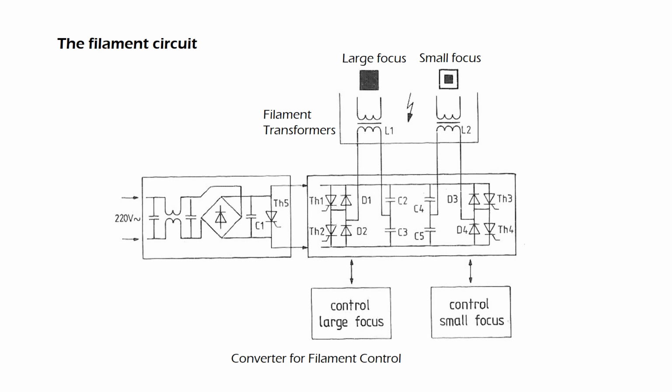During the exposure, the tube current control circuit takes over the control to send feedback of the measured actual tube current to the filament control circuit. The ignition frequency is varied or kept constant by the filament control circuit to maintain the desired tube current. We will discuss the filament control in the next topic, the generator control circuits.